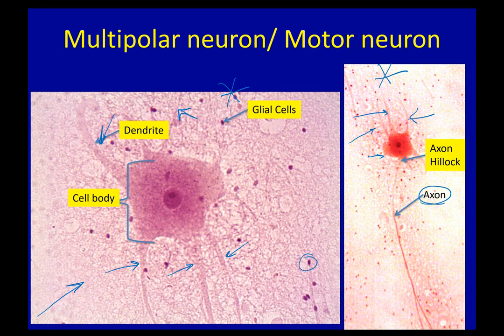Now, look at all of these dark circles. Every time that we've seen dark circles, we know that these are nuclei. In every other picture that we've seen, these are actually the glial cell nuclei, the cells that are taking care of this guy, because those Schwann cells that I showed you aren't the only type of glial cells. So these little dudes here are the nuclei of cells that are taking care of my neuron. You've got the nucleus and you've got the nucleolus, that dense body that's dead center in the middle there that you can't miss because its color is so much darker than the nucleus.